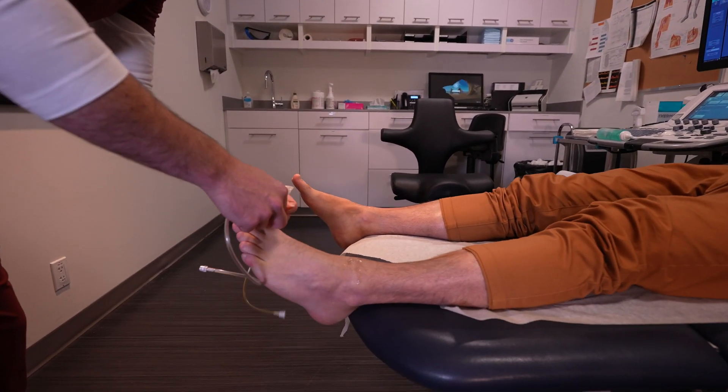Once the patient is changed into the appropriate attire, they'll be asked to lie down on the ultrasound bed. The technologist performing the scan will explain the procedure, where they're going to be looking, what they're going to be looking at, and what happens with the patient's results following the exam.